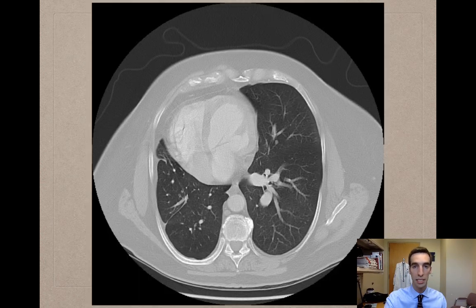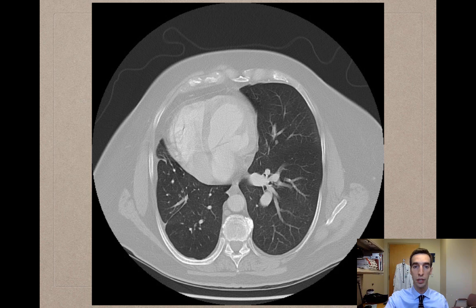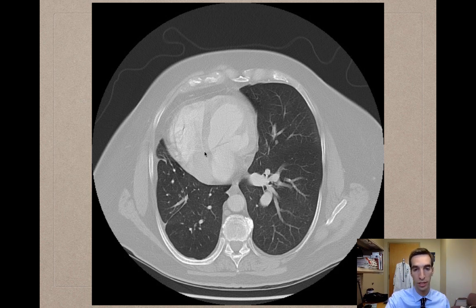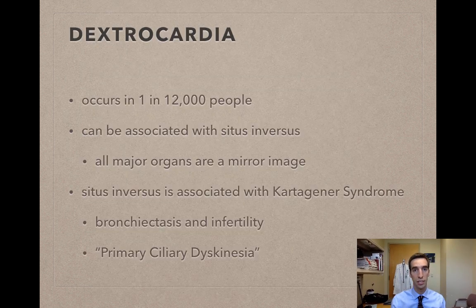Looking at the CT scan of this patient, you want to imagine yourself standing at the patient's feet and looking up towards their head. You can see that on the right side of the chest wall is the heart, and this is not normal. Another view confirms that the heart is on the right side of the chest — so we would call that dextrocardia.